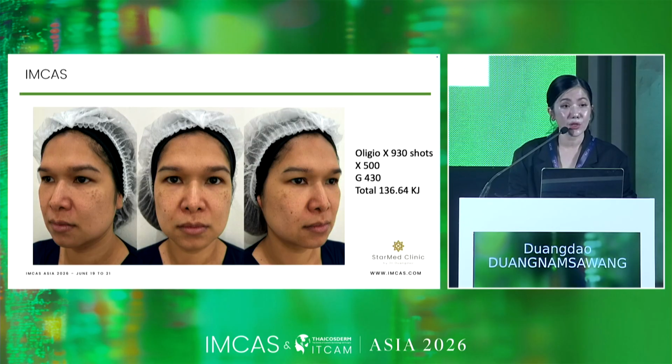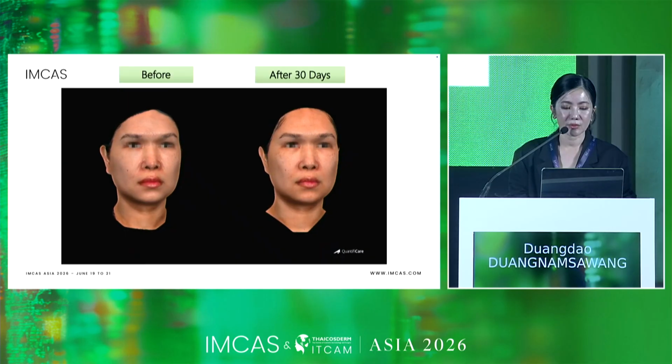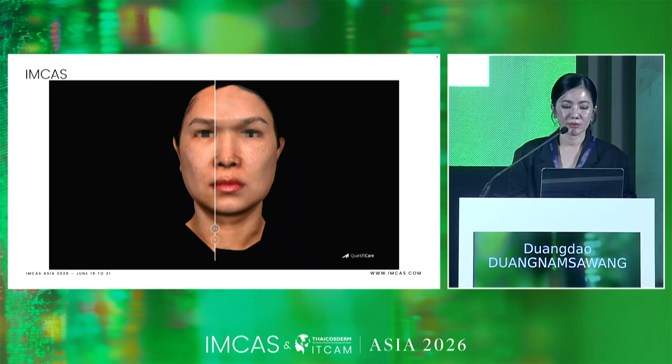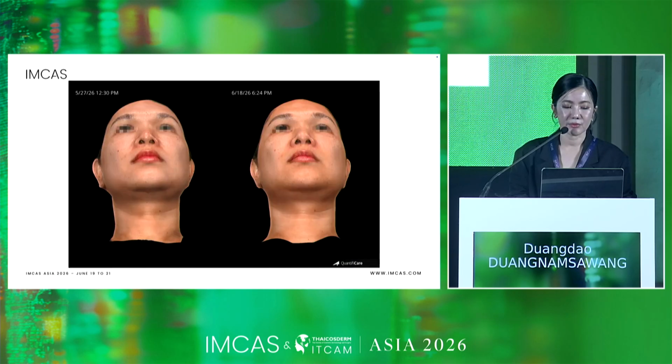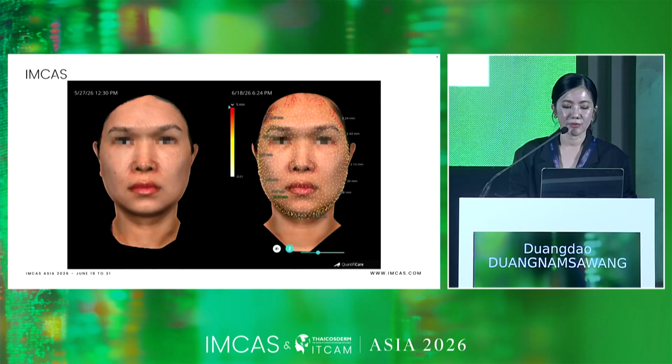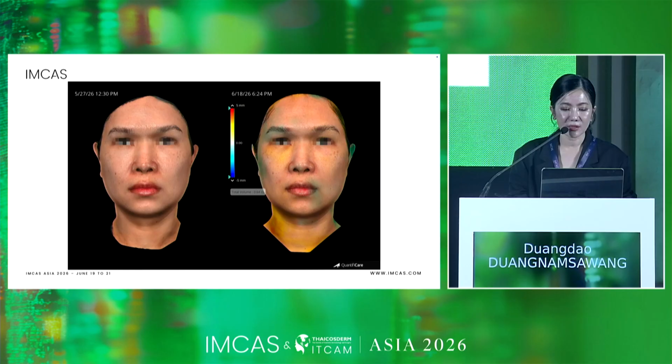The next case, we use the same 930 shots with high energy with moving technique. It's improved. The lifting tissue is improved on both sides.